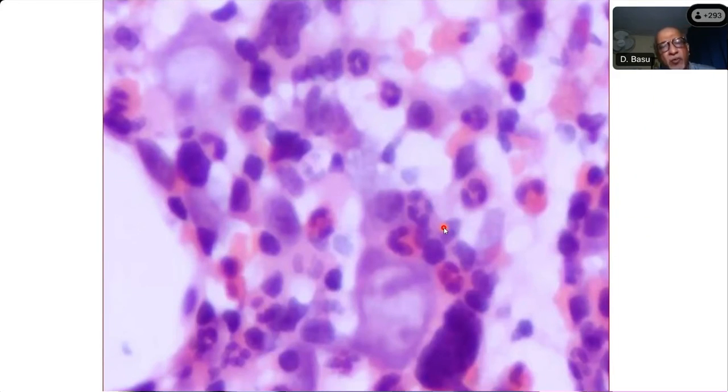So how would you identify them as erythroid cells? Suppose you are searching for them, what would highlight erythroid cells? Ritu? E-cadherin immunostain, sir. Okay. E-cadherin is a good immunostain. It highlights the early forms or the dyspoietic forms. So does CD71. But E-cadherin we use and we found very good results with it.